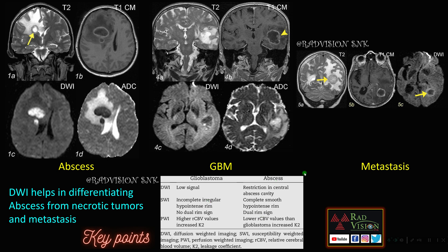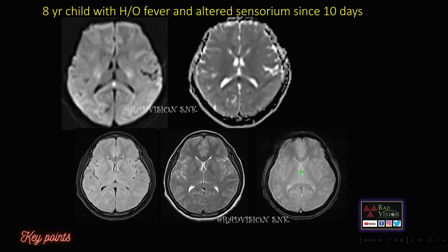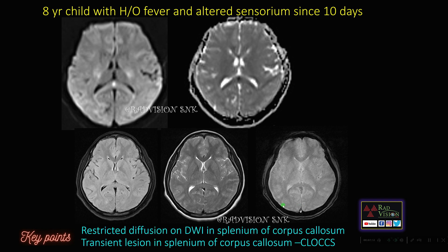Next: an 8-year-old child with history of fever and altered sensorium. You can see there is restricted diffusion on DWI in the splenium of corpus callosum. This is commonly labeled as a transient lesion in the splenium of corpus callosum, also known as CLOCS — cytotoxic lesions of the corpus callosum. The restricted diffusion on DWI in the splenium of corpus callosum helps in identifying CLOCS.